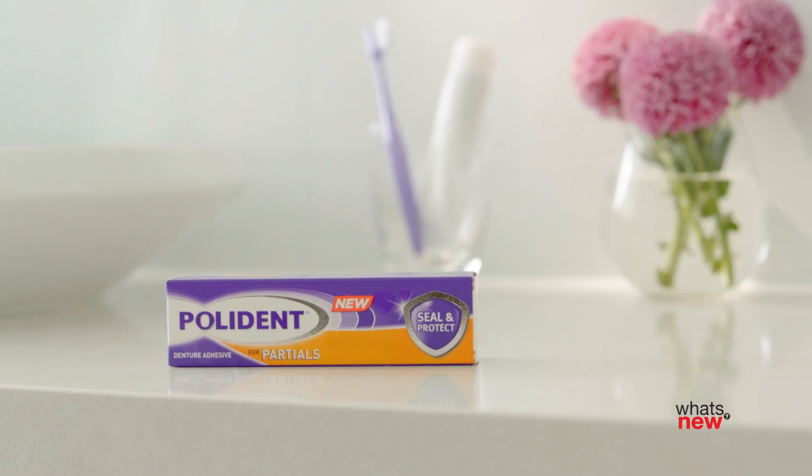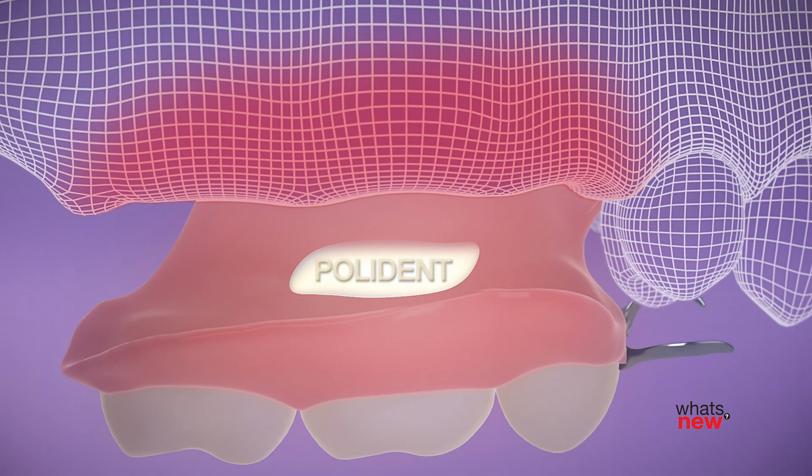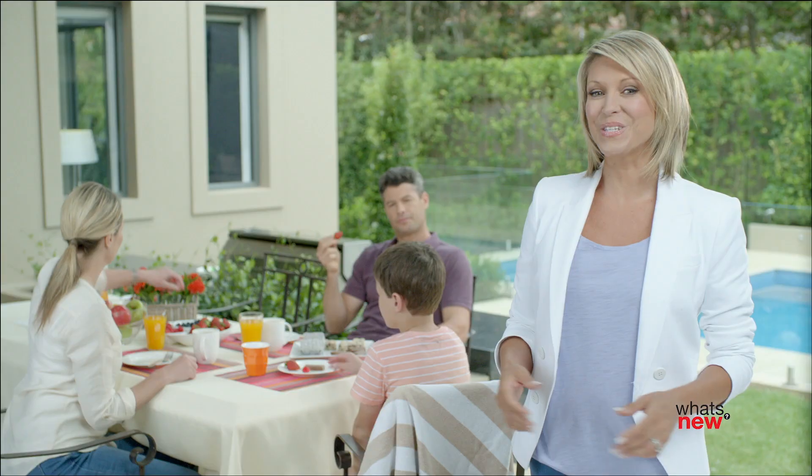New Polydent Adhesive for Partials helps protect your gums by creating a snug fit that helps seal out irritating food particles, so you can comfortably enjoy more of the foods you love.